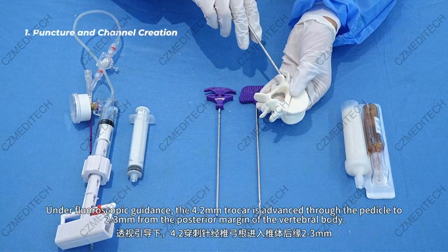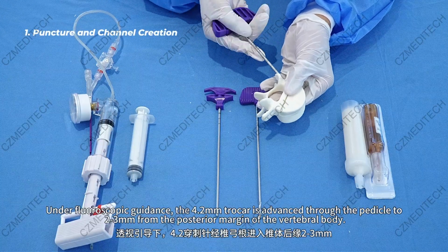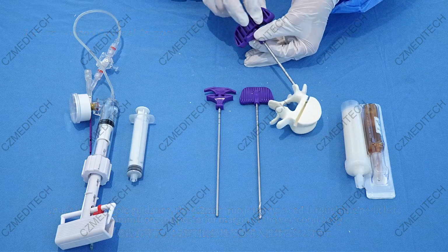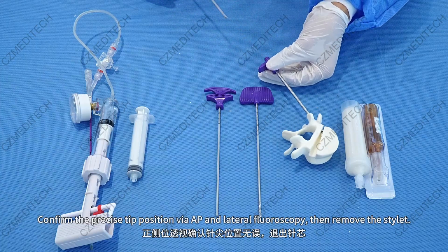Under fluoroscopic guidance, the 4.2 mm trocar is advanced through the pedicle to 2 to 3 mm from the posterior margin of the vertebral body. Confirm the precise tip position via AP and lateral fluoroscopy.